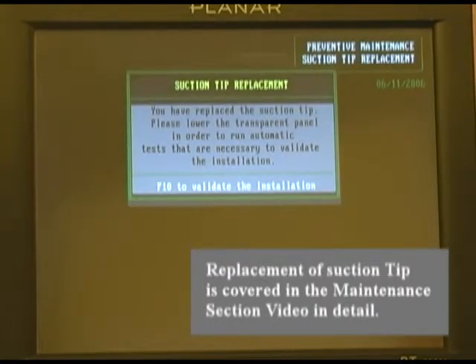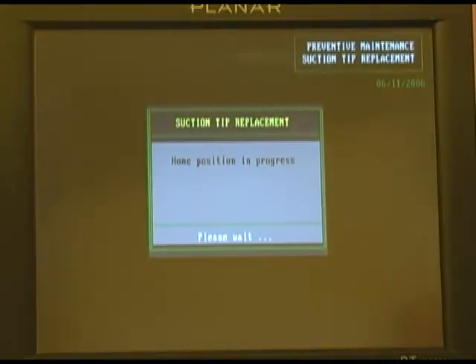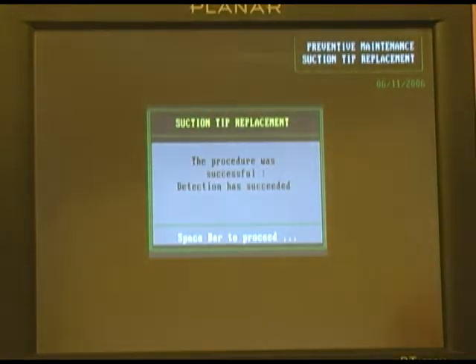Once you've replaced the suction tip, lower the transparent cover, and the instrument will run an automatic test to see whether or not you now are passing the vacuum test in order to move cuvettes successfully. Press F10 to continue. If the gripper is now working correctly, you will get a procedure is successful, detection of vacuum was present, hit spacebar to continue.